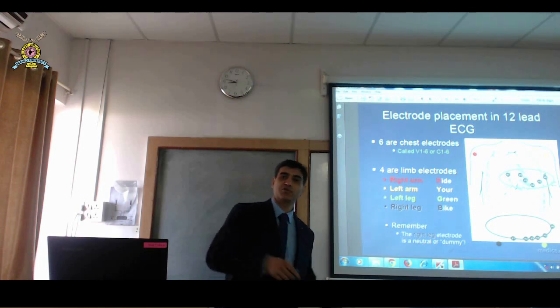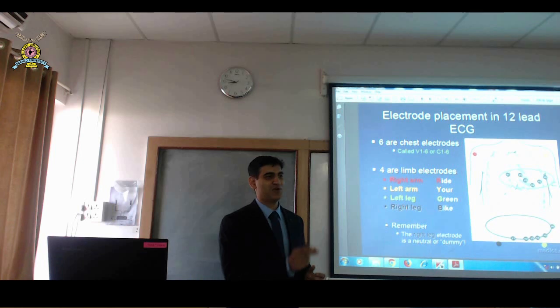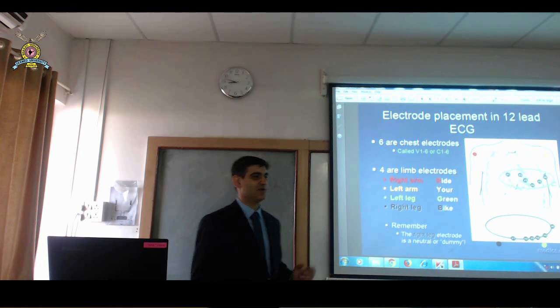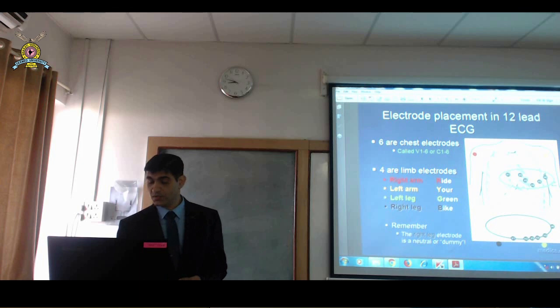And it's also cumbersome. You're going to make the patient lie in an odd position, and then you have to put an electrode. It's all going to be cumbersome, right? You don't have time for all that. So I'll tell you how to get the same information using the same leads. Okay?